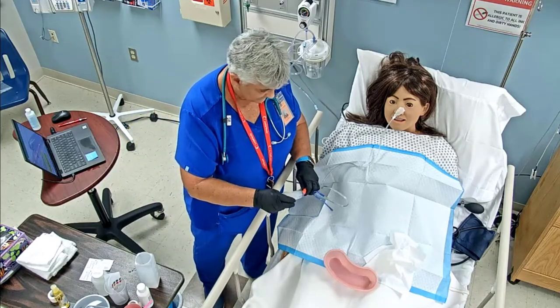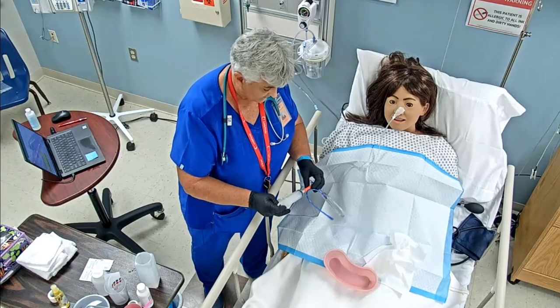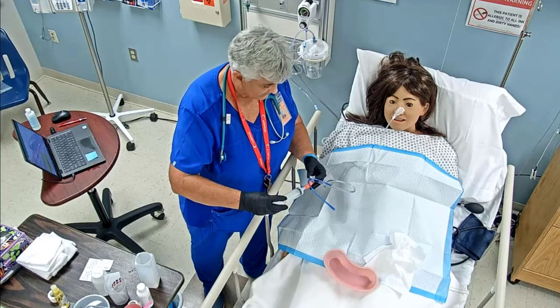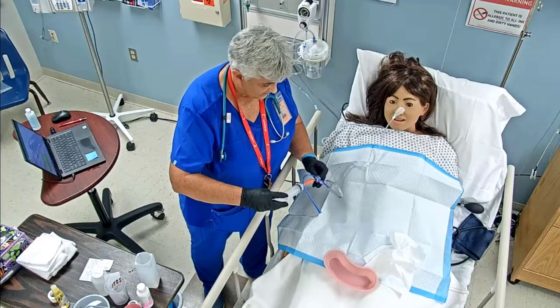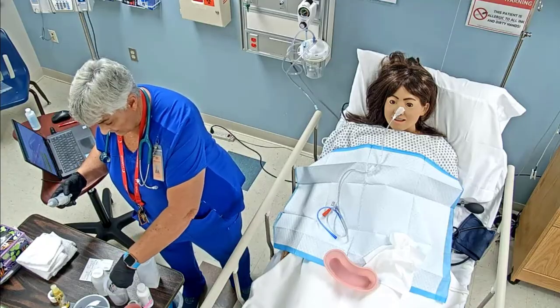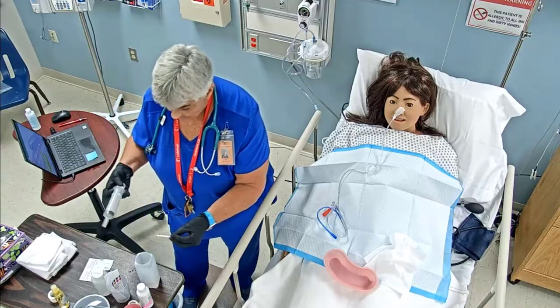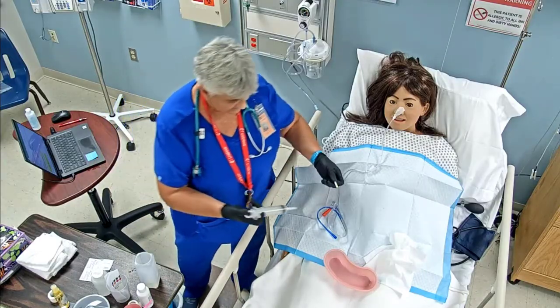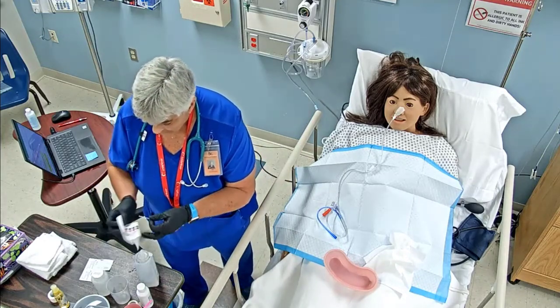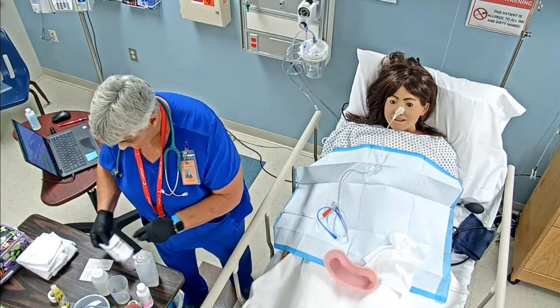I'm going to have my slip tip, make sure my stop is in the right place here. It is, and I'm going to aspirate a little bit of fluid, turn that off, and we're going to check it. We got just enough that we needed in there. According to how long it takes, we're going to read it. We're still at 4, so that means we're still in the stomach.